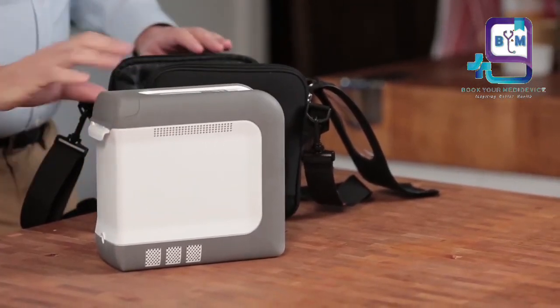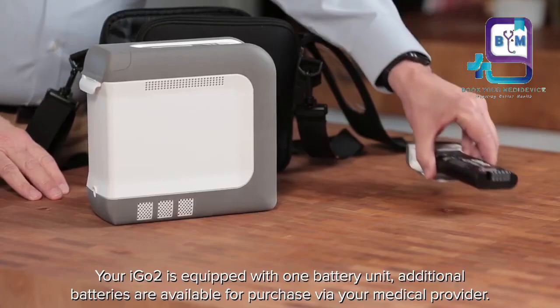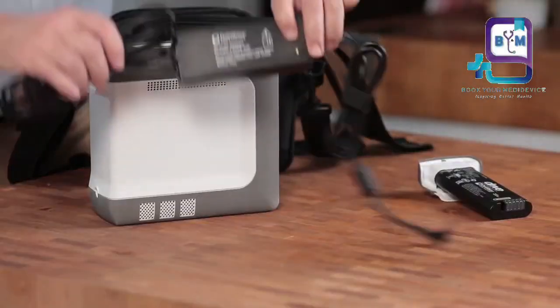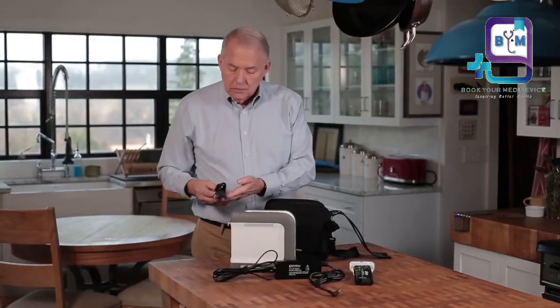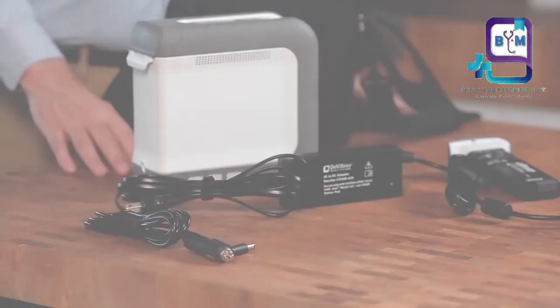The included items are: the iGO2 portable oxygen concentrator, a battery pack, the carrying case, power supply, AC-DC adapter, the AC power cord, the DC power cord for your car, the owner's manual, and the Mylar bag.